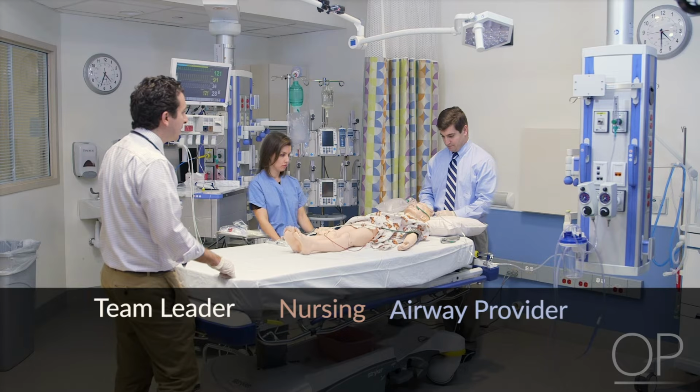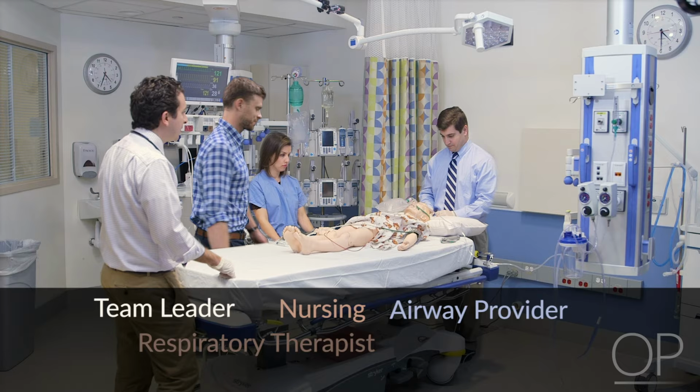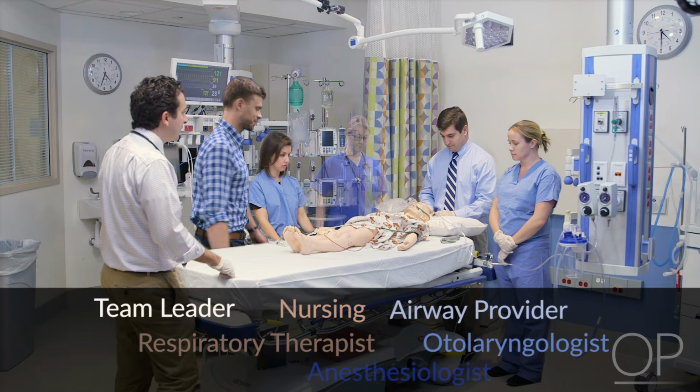Nursing staff, respiratory therapist. It is important to clarify the responsibilities of each provider present during the procedure, including who will be handing the endotracheal tube to the intubator, who will be securing the tube and providing positive pressure ventilation, and who will be observing the patient's vital signs during the procedure to alert the intubator of any significant changes. In cases of a known or anticipated difficult airway, an otolaryngologist or anesthesiologist with training in pediatric advanced airway techniques should be consulted whenever available.